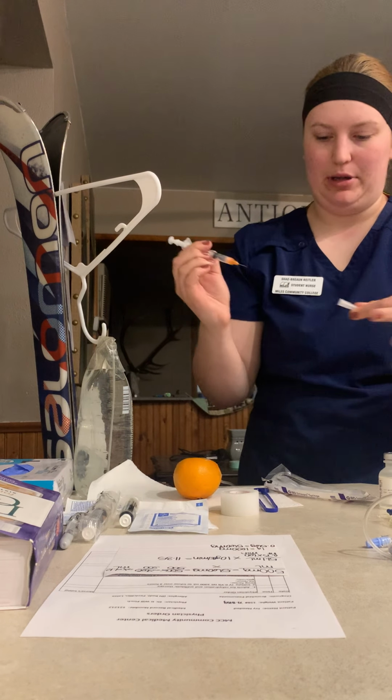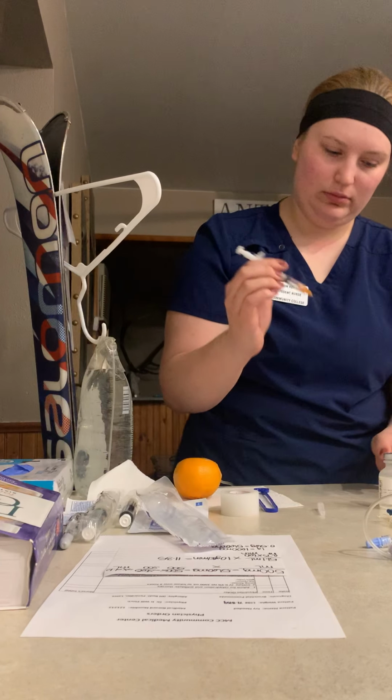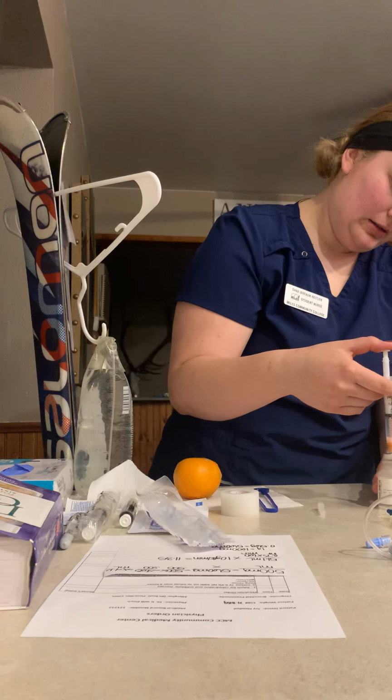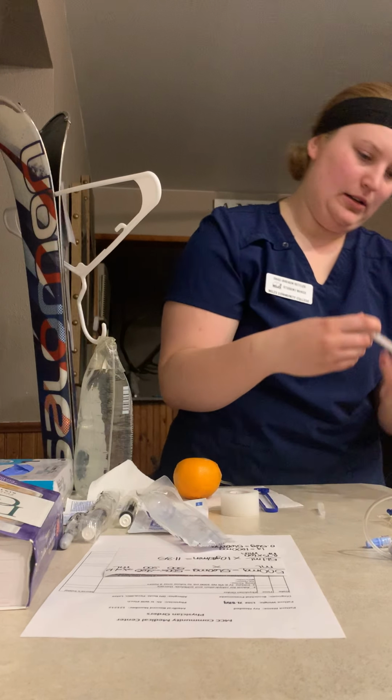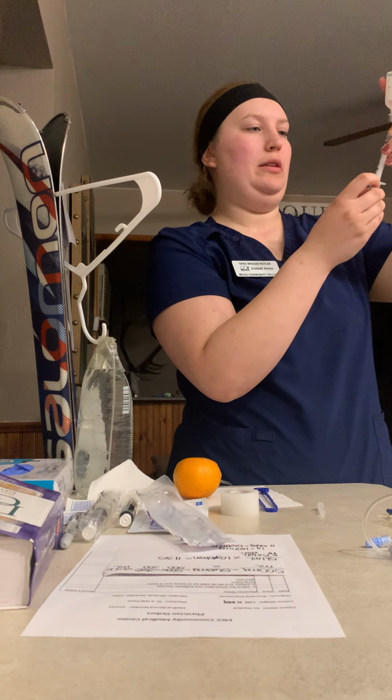I'm going to pull my cap off. I'm going to inject the air in, and then just pull back that 1.1.